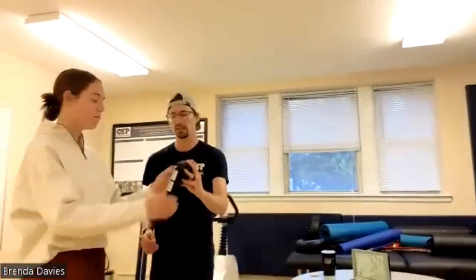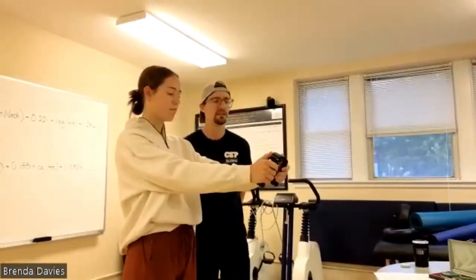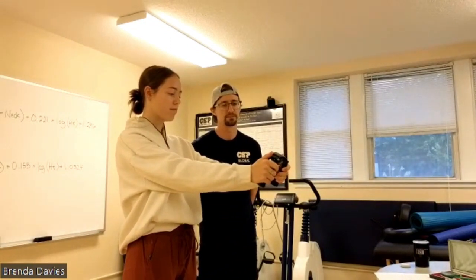So here's kind of what it's looking like. I don't know if you can see that very well, but you just hit set for each of these. We have her set up as an athlete who is 5'6.5", and go ahead and hold on to that just like you did last time. And then start. And just like last time, we'll have it propagate through those measures.